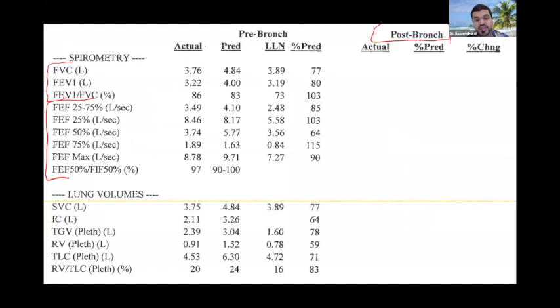The forced expiratory flow. The official recommendation is you don't report them, you don't say them. A lot of pulmonologists will look at these, especially this FEF 25 to 75% as an indicator of small airway disease. I don't wanna confuse you. Usually it's not asked during exams because there's a lot of debate about it. There's a lot of strong opinions and not as good data about it.